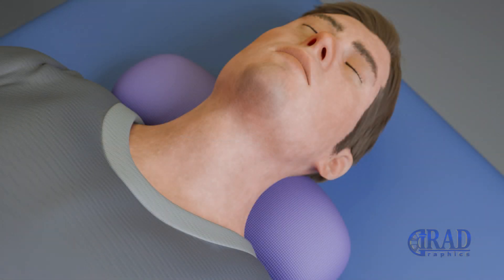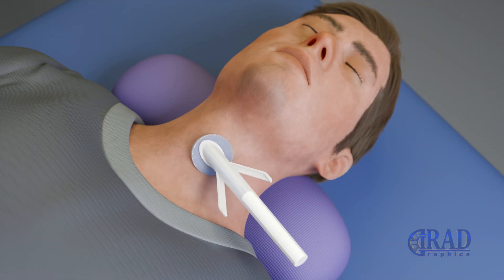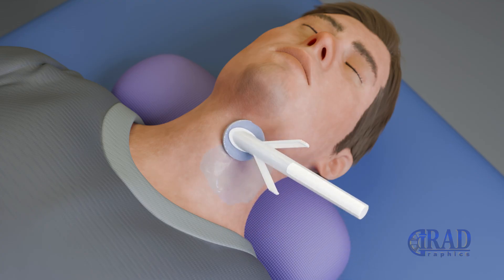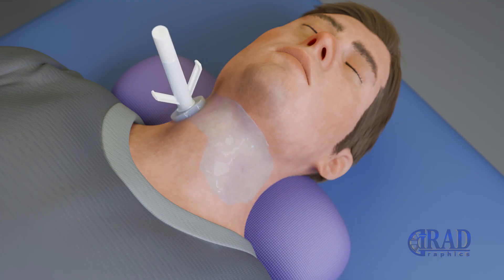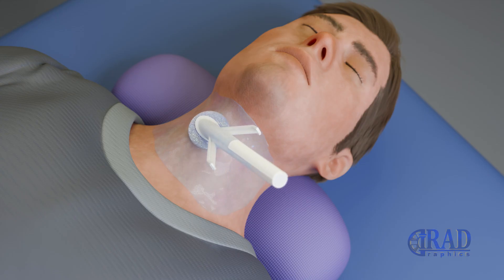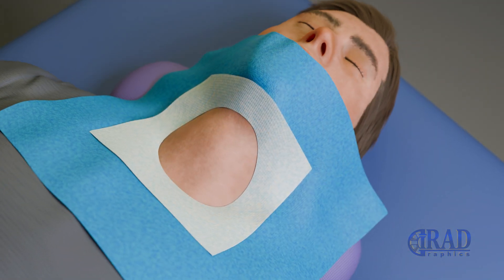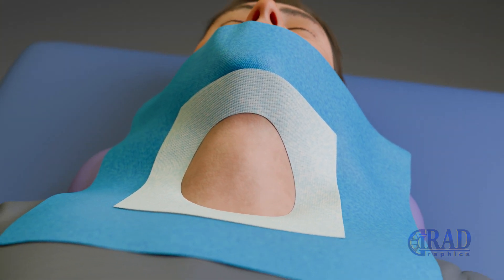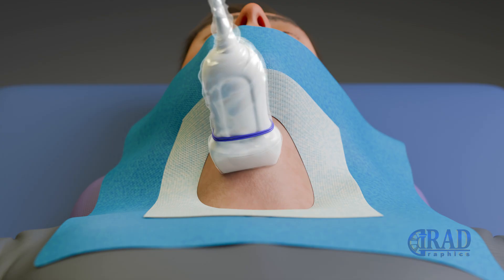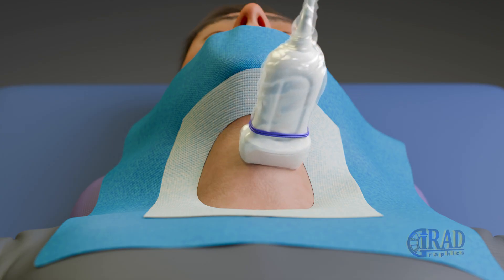The patient is positioned comfortably on their back with the neck gently extended. The skin is cleaned and draped. Ultrasound is used to map nearby structures and precisely locate the target nodule.